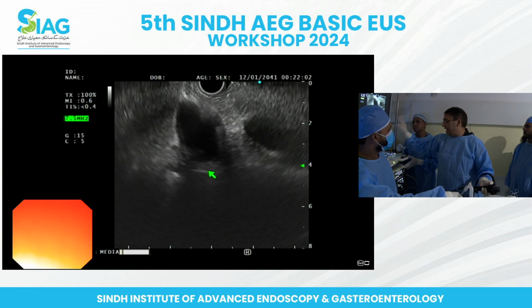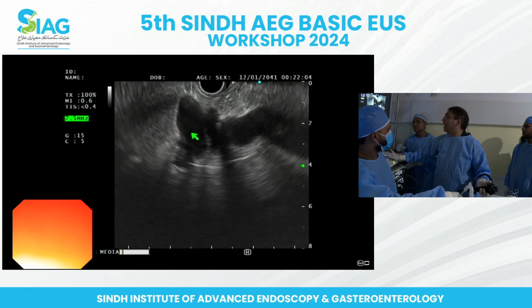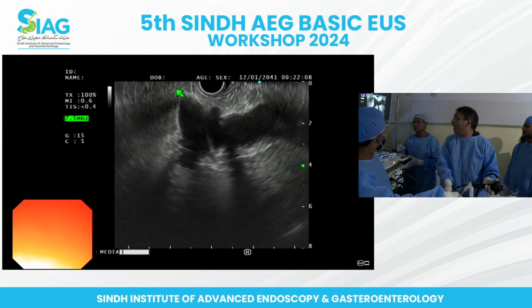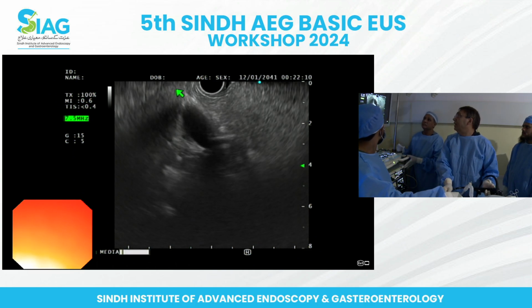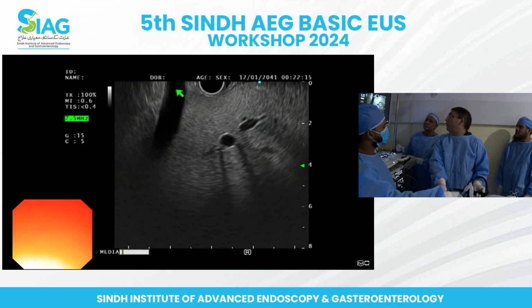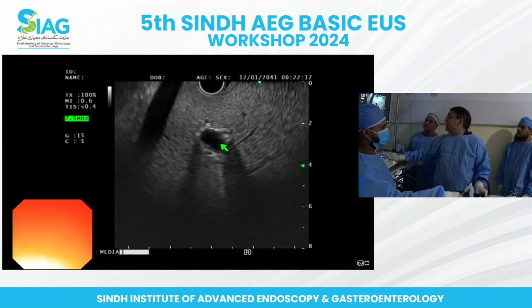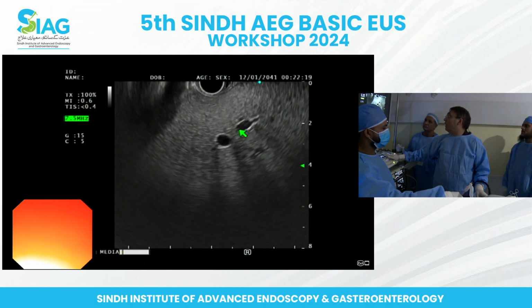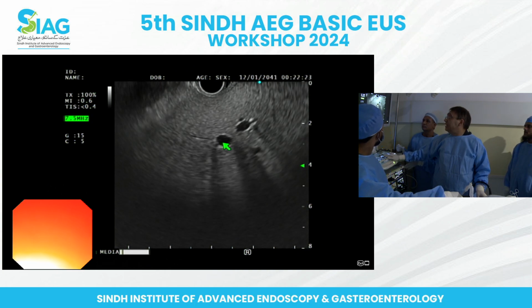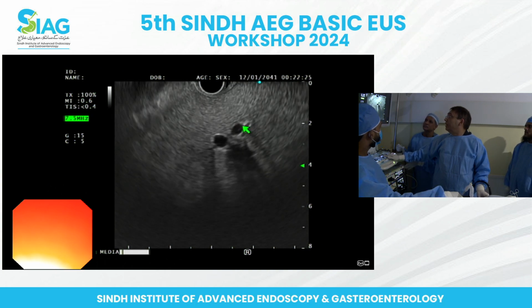We already saw that. I'm not going to spend my time on that. This is the right portal vein, which is going to go that way. You follow the right portal vein. Once you follow it, you see that right here, it divides into two major branches. One goes this way, the other goes that way. This is right anterior, this is right posterior.